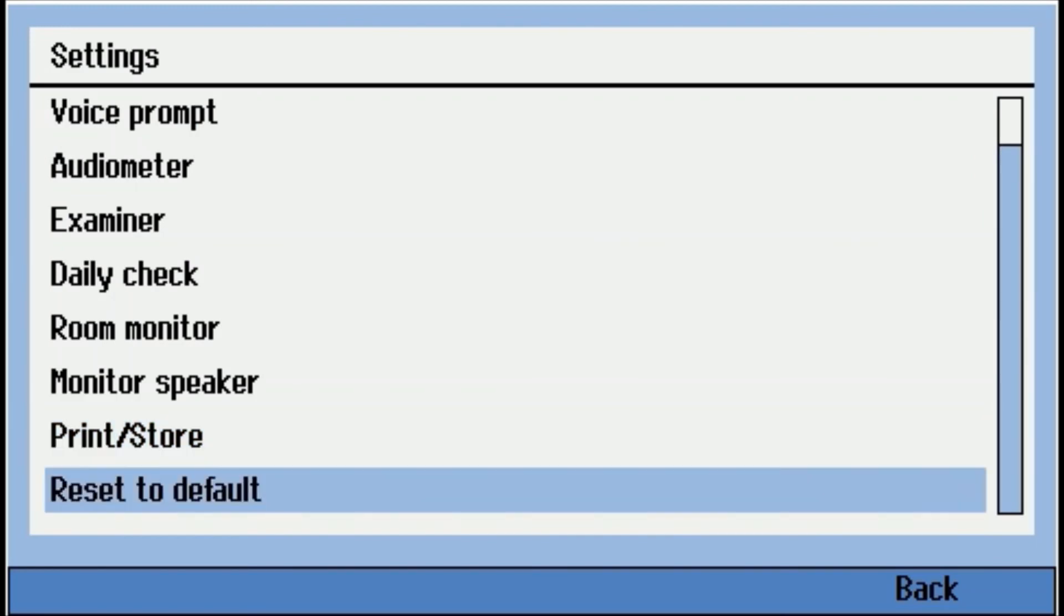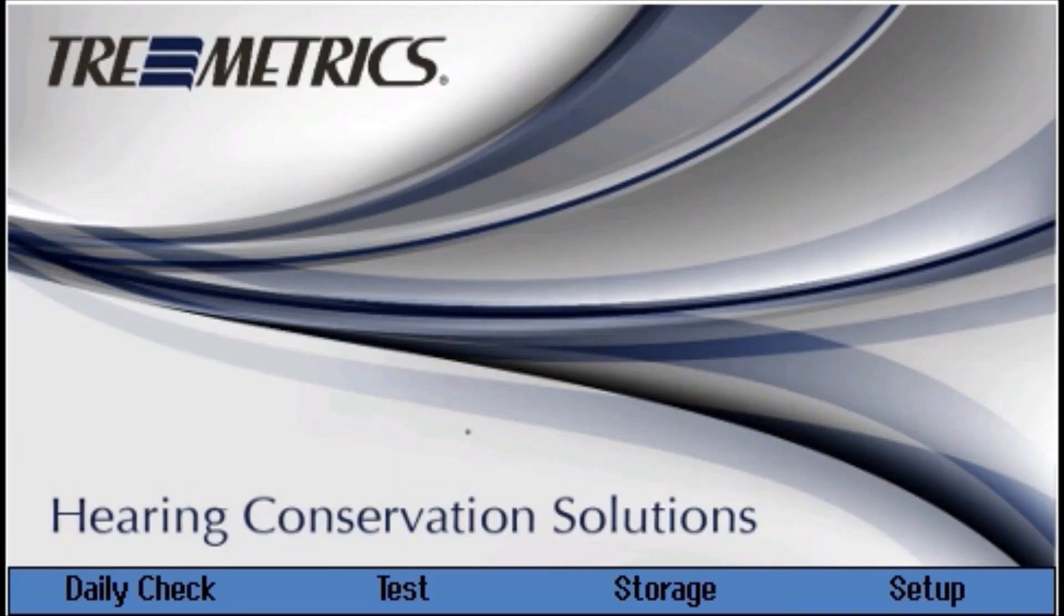And then reset to defaults. So that's about it for the settings on the RA 360 audiometer.